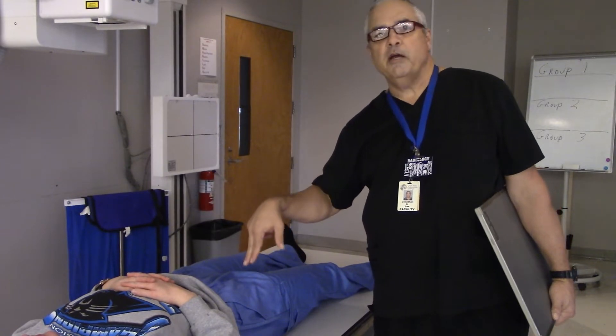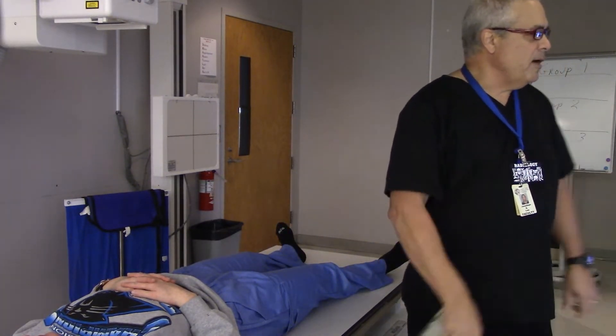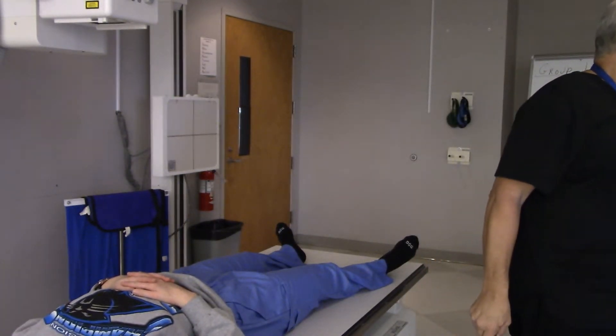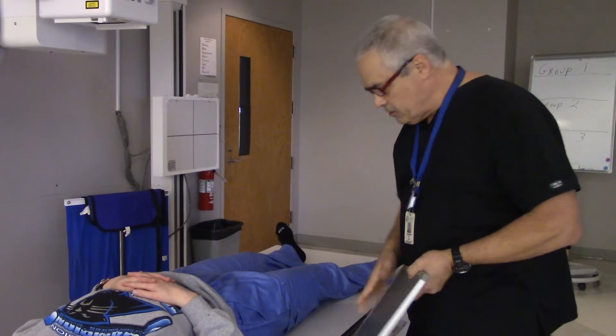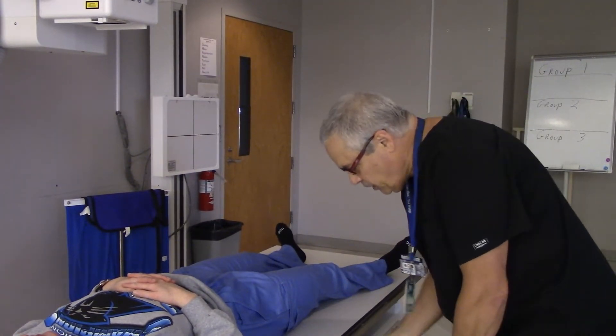Now I am just going to do some cone-down views of this right hip. Mr. Evan, if you wouldn't mind, hand me a smaller film. Thank you. Yes, sir — 10 by 12 is plenty. Of course, if you are using DR, it doesn't really matter; you are just going to be using a plate. But that doesn't mean you can't cone down some.